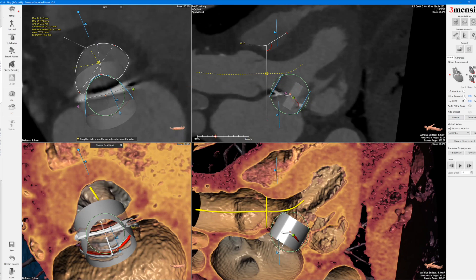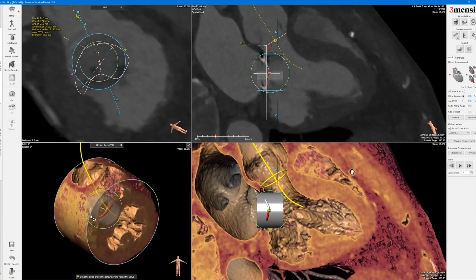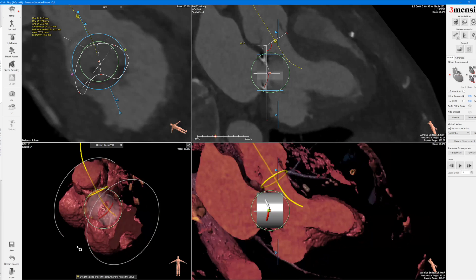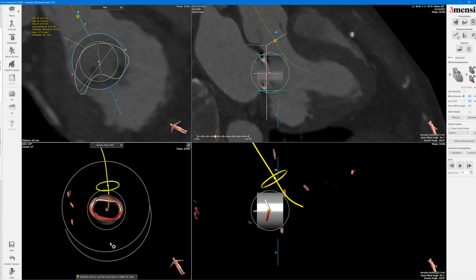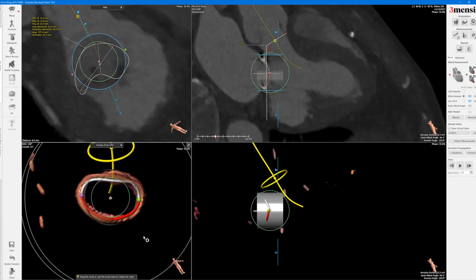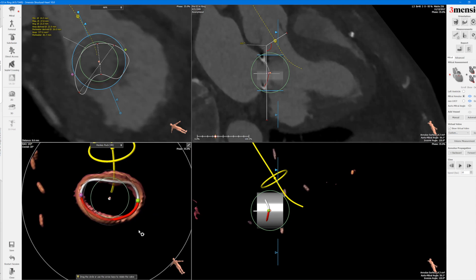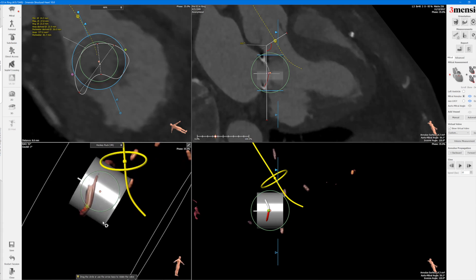After that, go back to the mitral annulus interface and go to the hockey puck view. Reduce the contrast and you can see how the valve might sit inside your ring and how constrained it would potentially be. With a semi-rigid or rigid ring it would be very difficult to circularize, and when you have a small ring you can imagine that on either side of the commissure where the ring sits there might be paravalvular leak because it's not able to seal with the transcatheter valve.